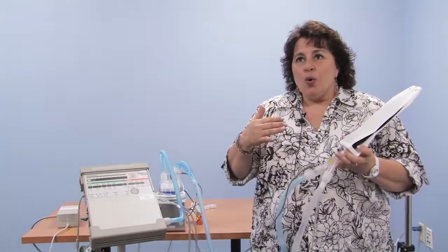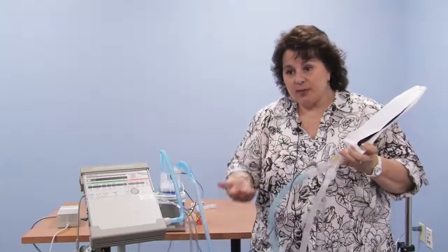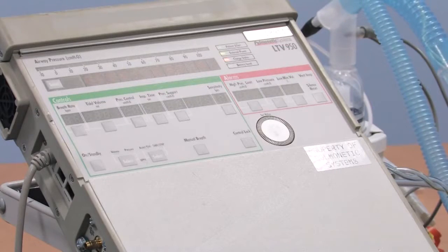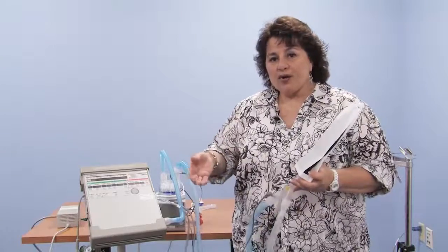The downside of 1 can be that if a little water builds up in the hoses and the hose starts shaking a little bit, it can actually tell the machine to trigger a breath. So your child could go to sleep, and they normally breathe, maybe 30 when they're asleep and very comfortable, and then you start getting high breath rate alarms from the ventilator. Or sometimes people get what's called the apnea alarm, cessation of breathing, because the machine didn't see the patient effort light go on. They didn't sense the child taking any breaths. And that happens because the water in the hoses can cause what we sometimes call auto-firing or auto-triggering. The sloshing of the water makes the machine think that the child wanted some air by displacing air in the hose, and it fires.